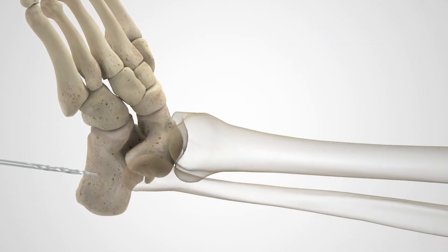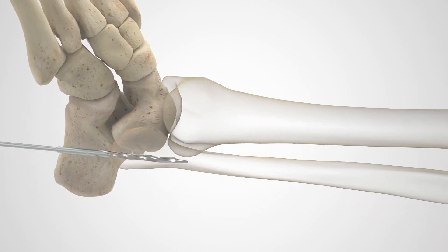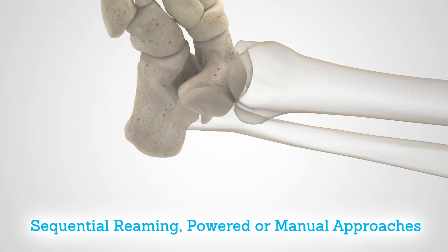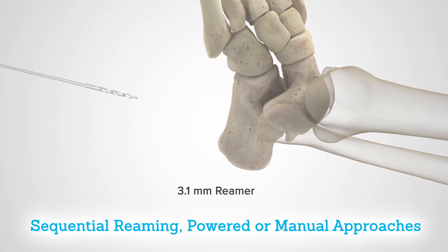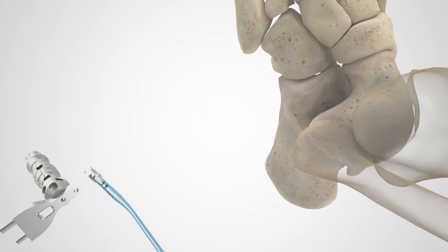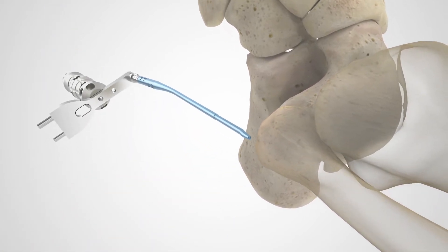Using a minimally invasive technique, the Fibula Nail 2 is designed to be inserted through a small incision percutaneously. Sequential reaming offers a straightforward method for intramedullary canal preparation through powered or manual approaches.